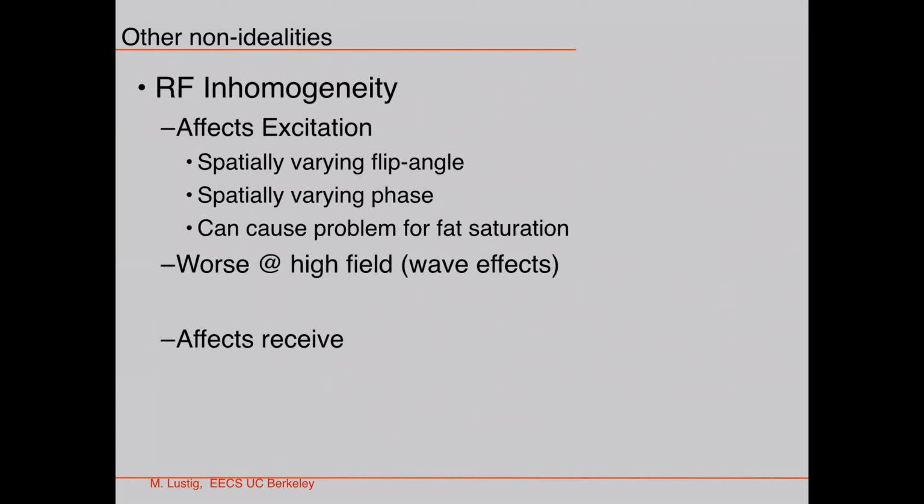If I want to do an inversion, for water to really cross 0 at the right time, well, if it's a 170 or a 160 or a 180, it doesn't cross at the same time. And so now my suppression of water is not going to be as nice. I'm going to have spatially varying suppression of water, and that could be an issue because suddenly CSF starts showing up in some places.